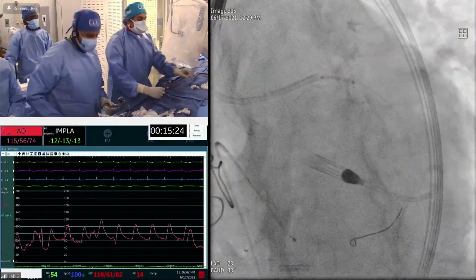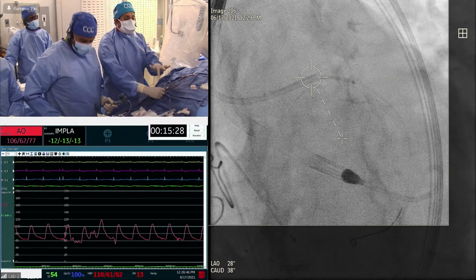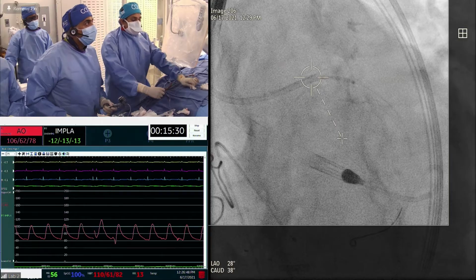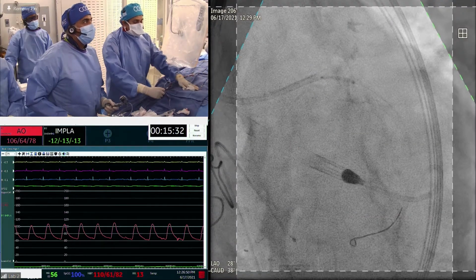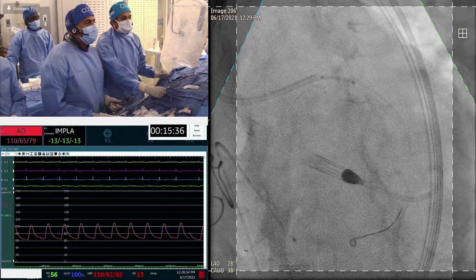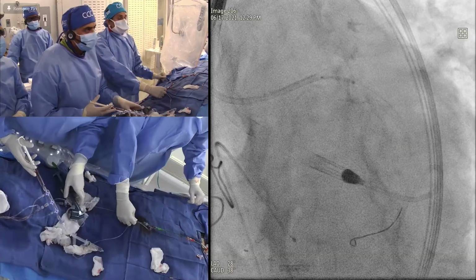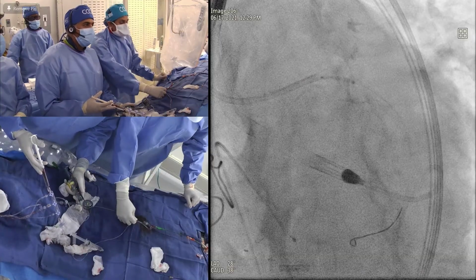Yeah, the interesting point, Roxana, you see, sometimes it causes deformation. I advanced it very easily. If the Guidezilla would not have gone easily, I will not push. Yes, there can be stent accordion, exactly what you mentioned. In that case, I have to go back with the balloon, distal to where it is, dilate it, and then advance over the balloon only.